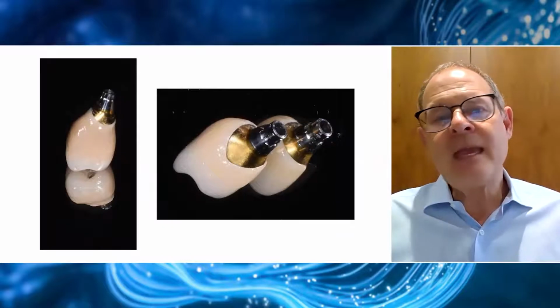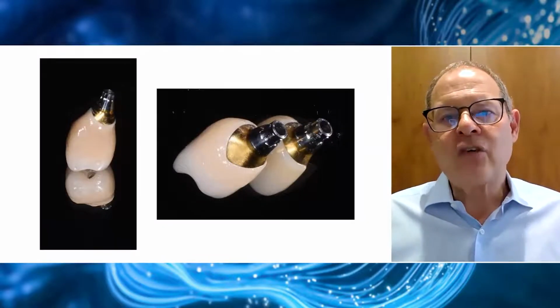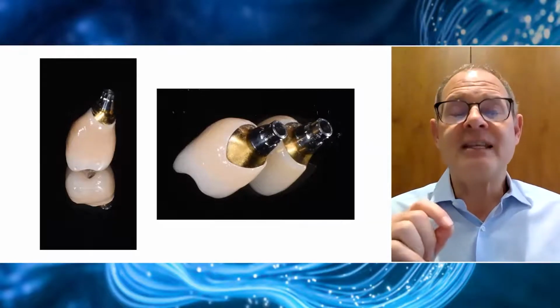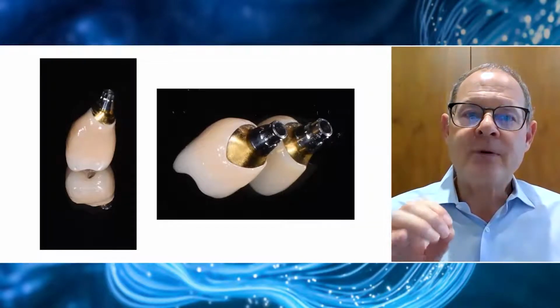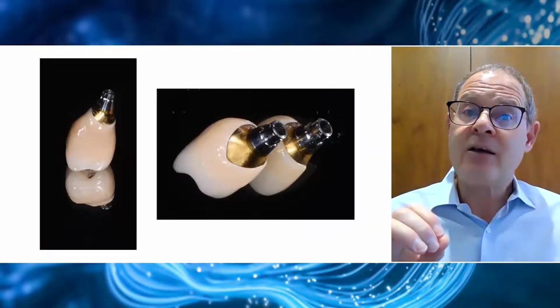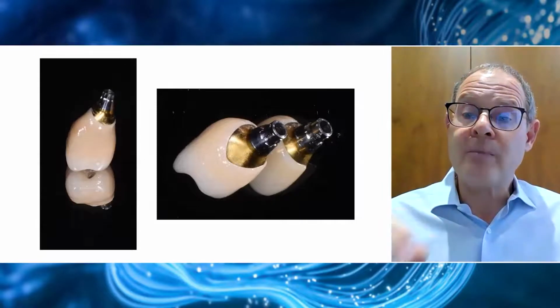And for me, undoubtedly, the soft tissue response is impeccable. It's often the case that we cannot probe between the soft tissues and these restorations. And if we can, we're struggling to get beyond 2 millimeters.